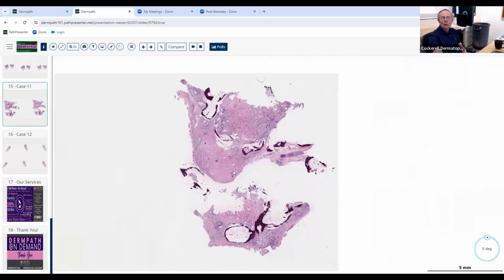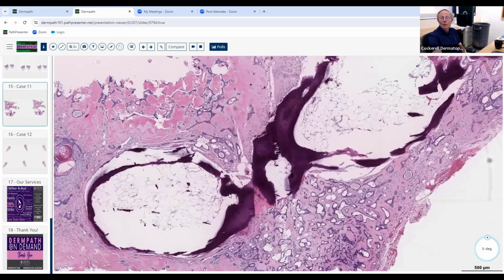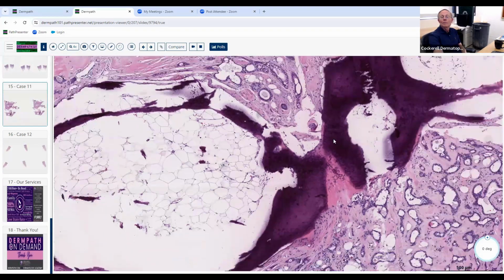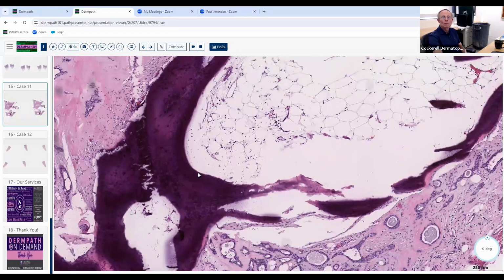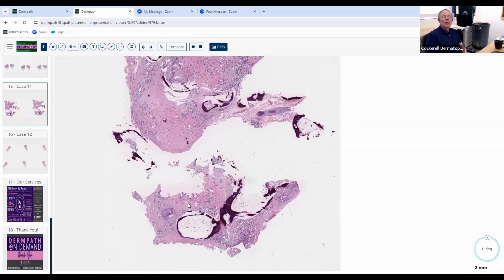So, mixed tumor of the skin with ossification. Interesting example. The other thing that's interesting about osteoma cutis is you can actually get bone marrow that forms in the middle of the bone. So you may even have a little bit of that bone marrow forming over here. Just kind of an interesting finding. You don't need to know necessarily much about that, but this is the bone marrow that's forming in the little osteoma cutis that developed in that mixed tumor.